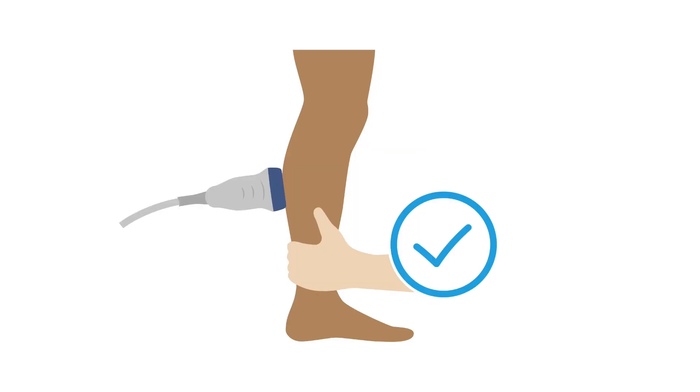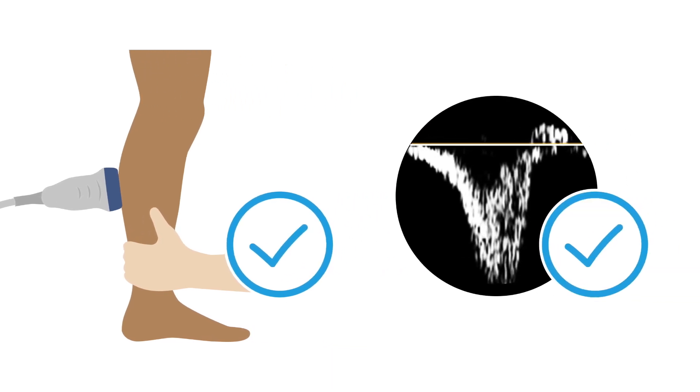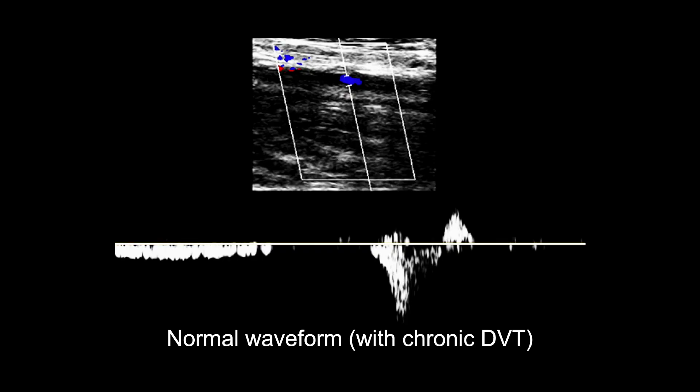Distal augmentation can be performed on a chronic clot because of its increased adherence to the vein wall, and should also show a normal upside-down peak demonstrating an augment of flow below the baseline. In this image, you can only see a small patch of blue in the vein at the top, as there is chronic clot present. The clot is only partially occlusive though, and so the waveform still shows phasic flow and a normal distal augment.